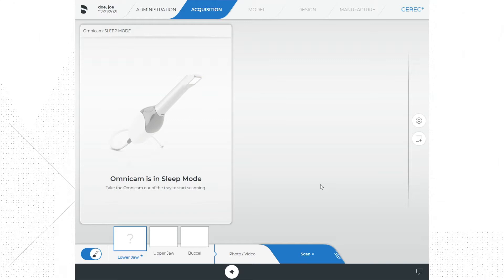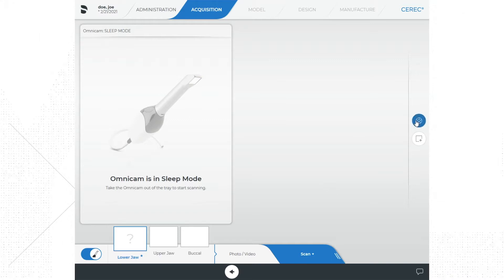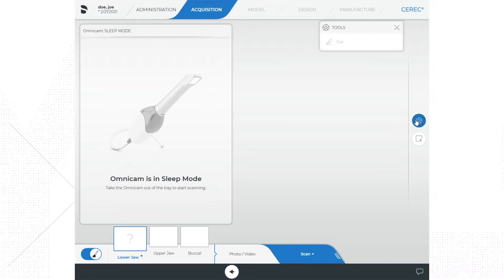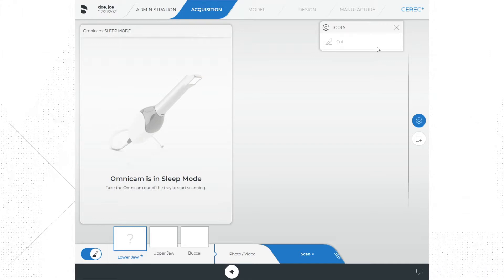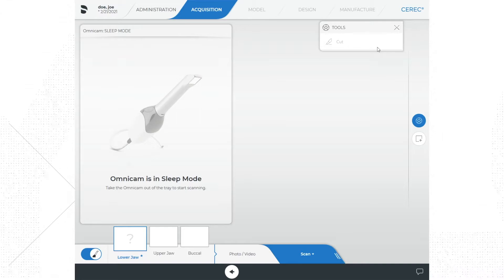To the right side of the screen is the tools menu, indicated by a circle icon. When you click the tools menu you only see an option at this time to cut the model. This allows you to remove a section of the scan.